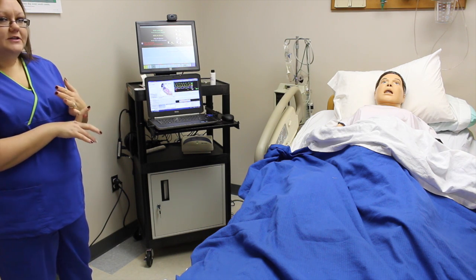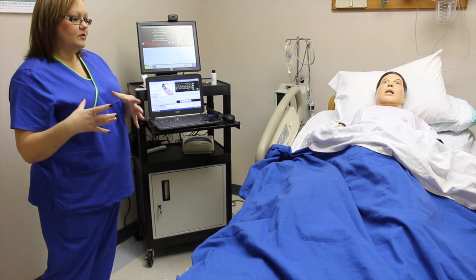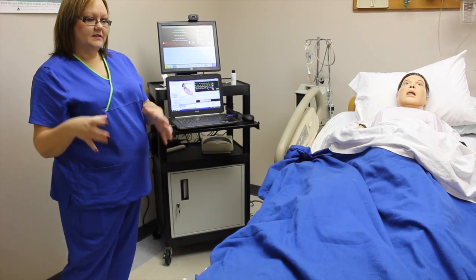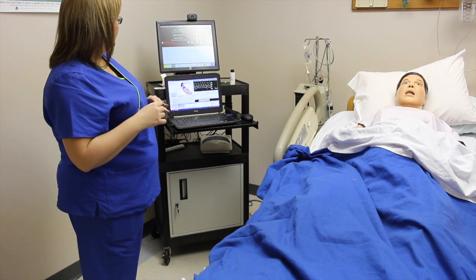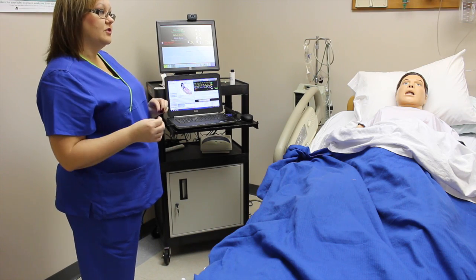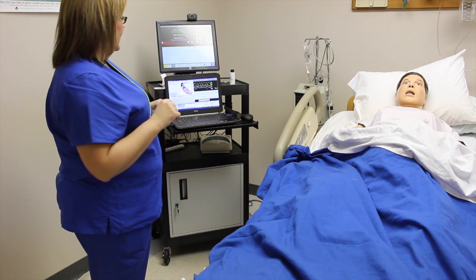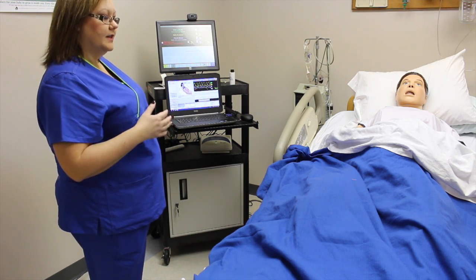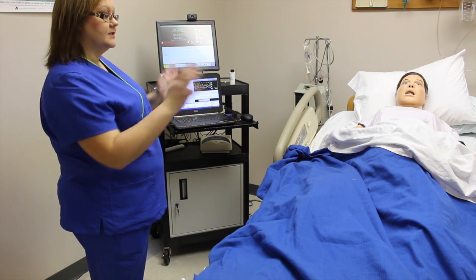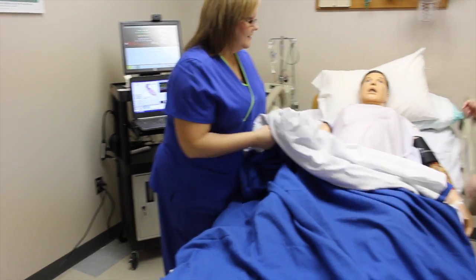Now, early decelerations are typically benign. It shows that the fetal head is coming down into the pelvis, and as the fetal head descends, you get compression, and therefore you get the deceleration of the heart rate with the contractions. So they look like what's called a mirror image of the contraction. If these progress, and the patient's early on in labor, one of the things you can do is turn the patient over onto their side, which we'll show you now.